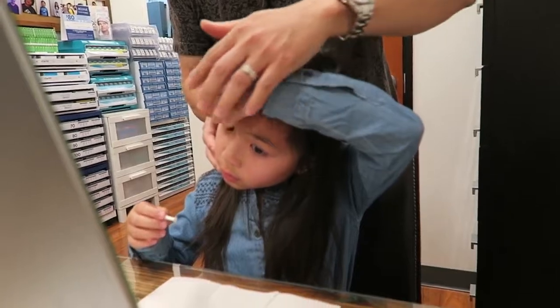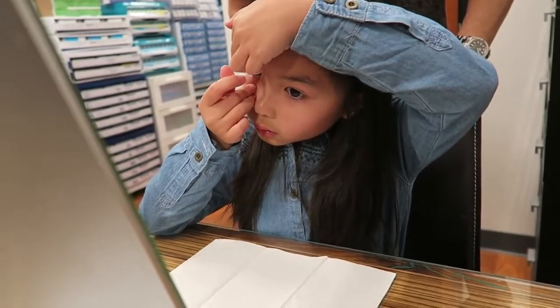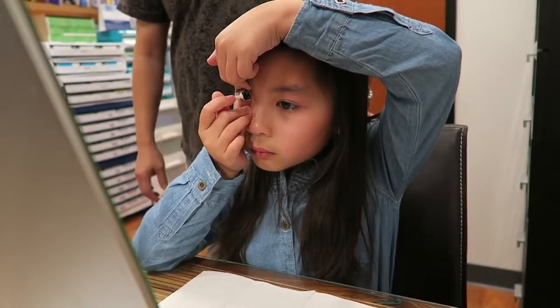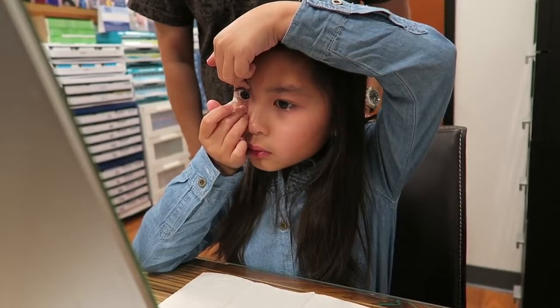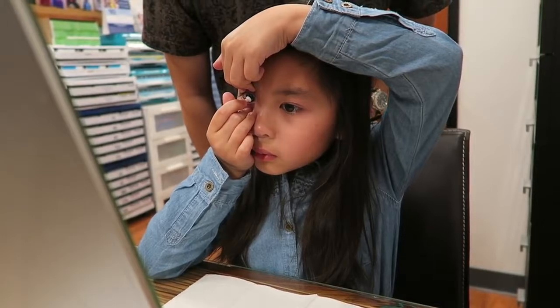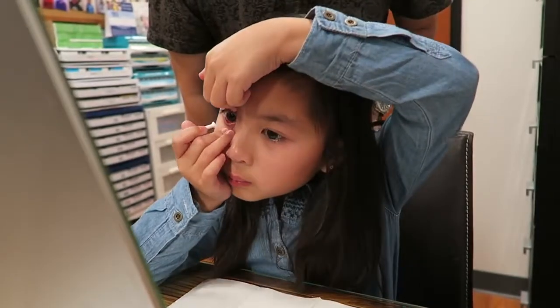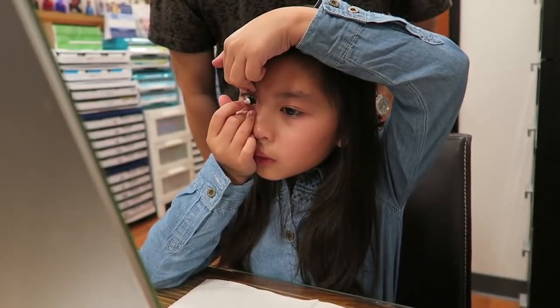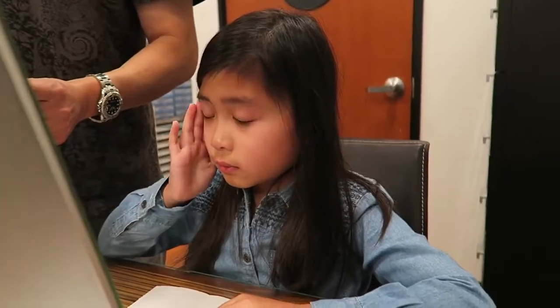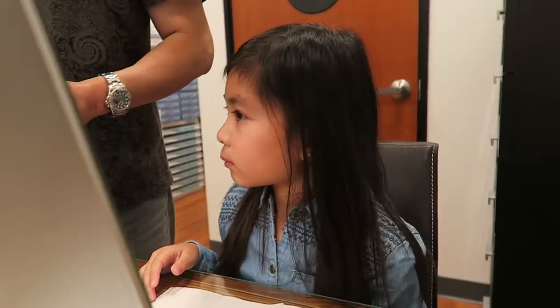You hold it like this — two fingers, one out first. Pull up your eyelashes, go underneath, and pull it out. Bottom one — line your eye up straight, then bottom one. Press in. Don't run away, look straight in the mirror. Press it harder, then take it out. You need to press a little harder. Good job! You got it out! Give a high five — wonderful!